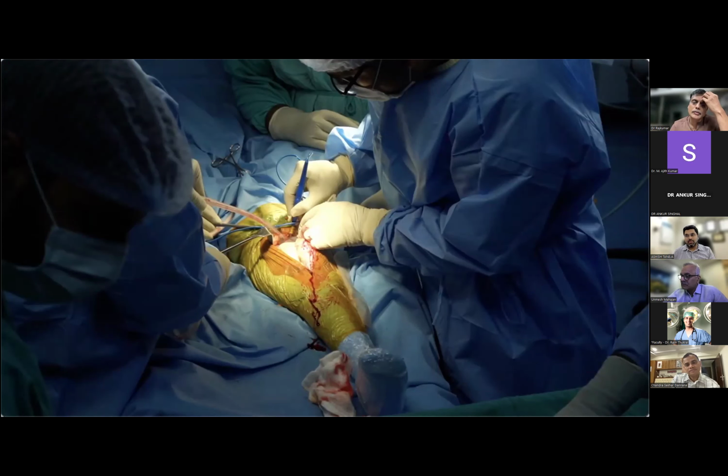Even actually, I was also using a lot of articulating spacers, but now moved towards static spacers. A couple of things: at the end, how skilled you are to mold the articulating spacers. If not, you are using a ready-made, but ready-mades are costly, and sizes are a problem. Having said that, now with some literature also supporting static spacers, the eradication of infection, and because there is no big difference between the functional outcome, whether static or dynamic, you get the movement.